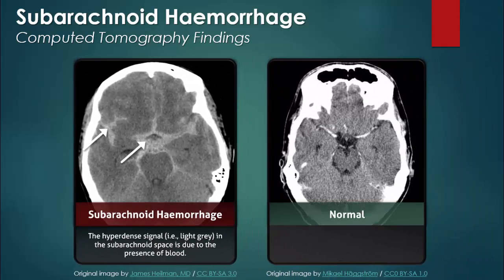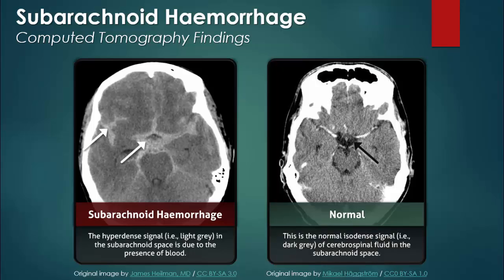Now let's compare it with the normal CT scan on the right. The black arrow in this CT scan also points to the location in the subarachnoid space, but in this patient the signal is isodense, dark gray, which is the normal shade of cerebral spinal fluid on a CT scan.